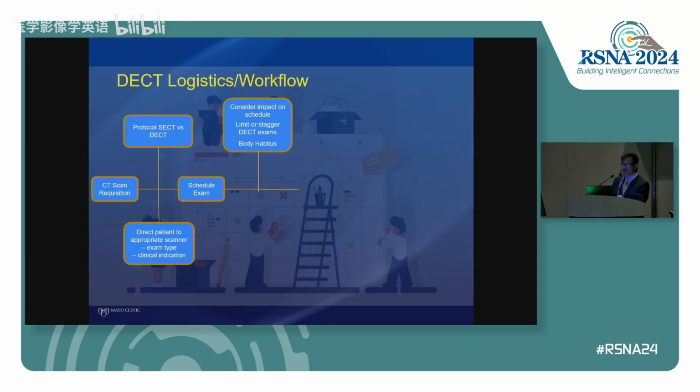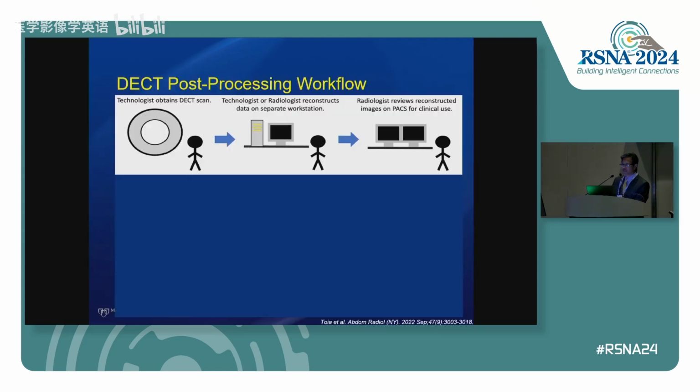So now you've scanned the patient, then those images should go to the scanner, right? So then we're done. Unfortunately, there are some additional post-processing steps with dual energy CT.